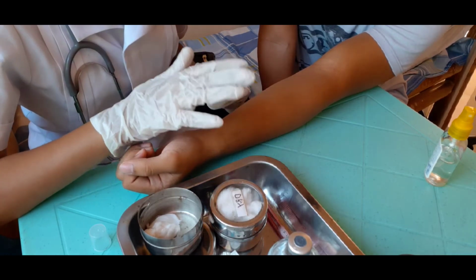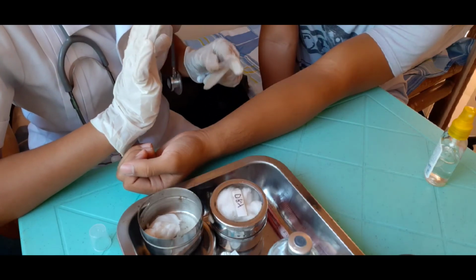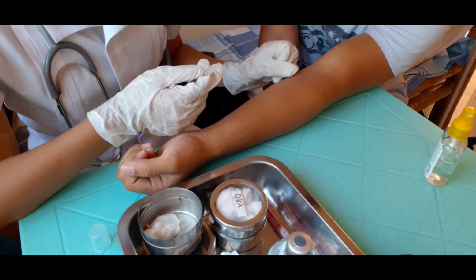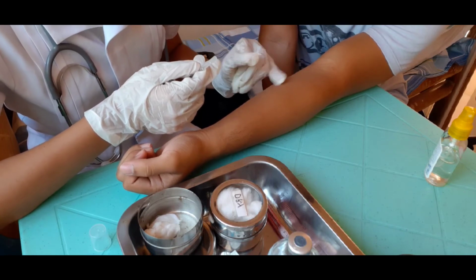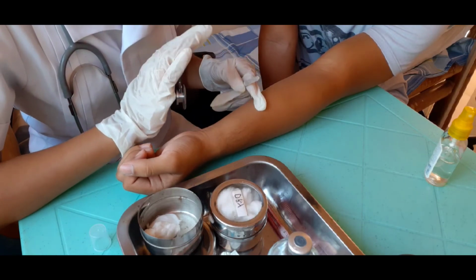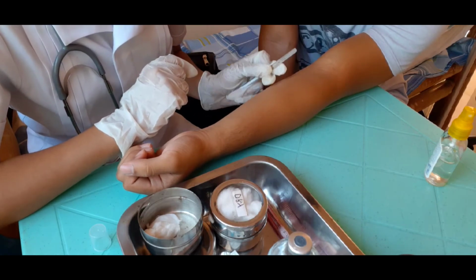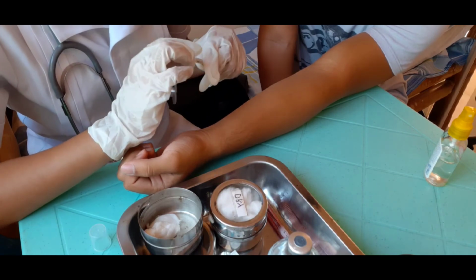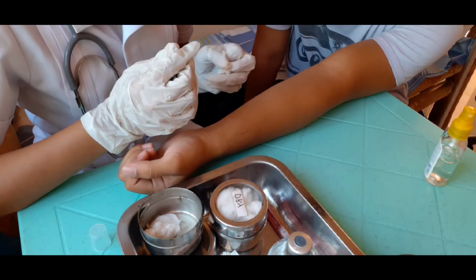So we are going to explain to the client that the medication will produce a small wheal. So it is sometimes called a bleb. So sir, after the procedure, makakita ka unay mo laboratory, which is a blood. So, okay naman ni mo, sir, no? And then, it will not affect it. So, a wheal is a small raised area which is like a blister, and then the client will feel a slight prick as the needle enters the skin. So, some medications are going to absorb slowly through the capillaries, which is into the general circulation. So, now we are going to do the procedure, and then select the site.